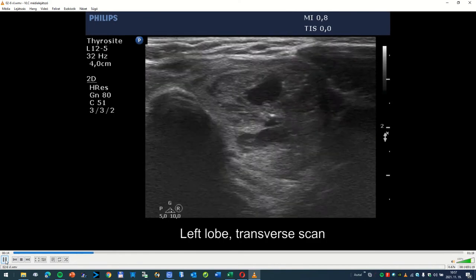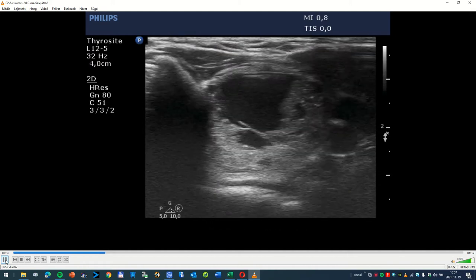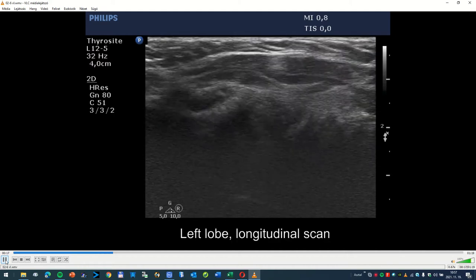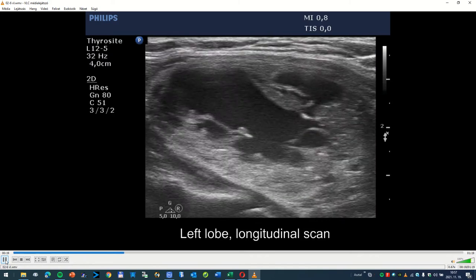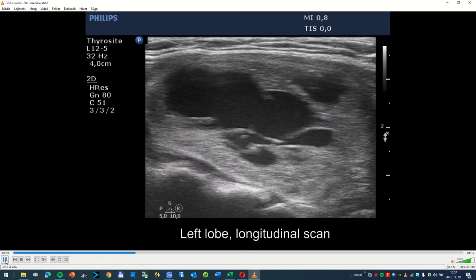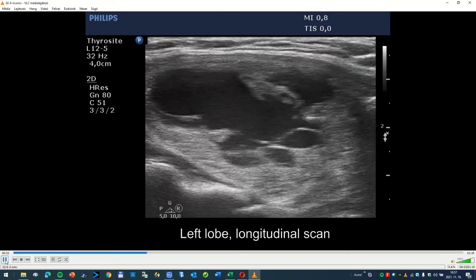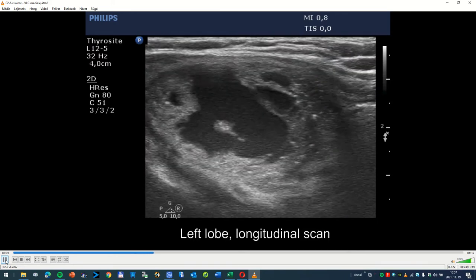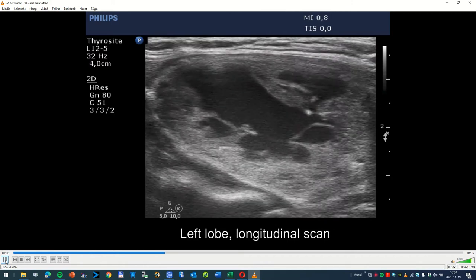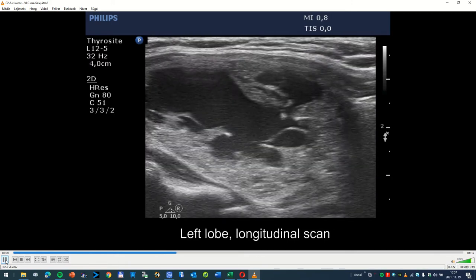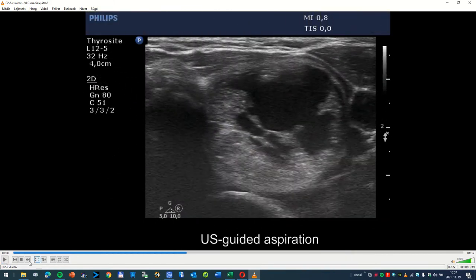The left nodule has a large cystic lesion. The amount of cystic fluid is almost equal to the solid part, so this can be interpreted either as a dominantly solid or a dominantly cystic nodule. Most of the intranodular echogenic lines are clearly related to ventral cystic areas. This form, and this one, and this one are back wall figures.